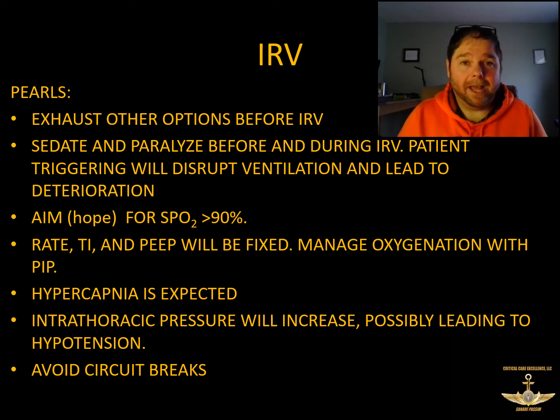As a side note, it's not on the page here, but it's worth talking about: make sure you don't run out of oxygen. When you get there and you decide you're going to have to do this mode, find a way to plug in to the hospital oxygen supply at the bedside so that you can have a good long time to get this set up and make sure the patient's going to do well on our ventilator with this mode. And then make sure you have plenty of oxygen for every step of the way after that. Make sure you've got plenty of tanks to get you from the hospital to the aircraft or the truck, and then make sure you have obviously plenty of oxygen in your vehicle, and then make sure you have plenty of oxygen when you arrive at your destination.